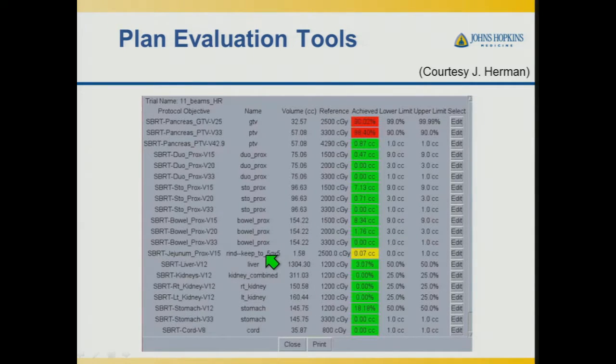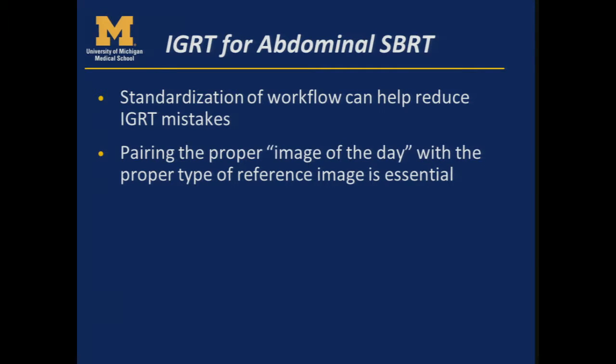And it's always useful to have really good plan evaluation tools. This is an example of a tool that they have in their planning system, where it's kind of like a scorecard for all of the many dose objectives that they have. And so tools like this are really helpful for evaluating SBRT and IMRT plans.